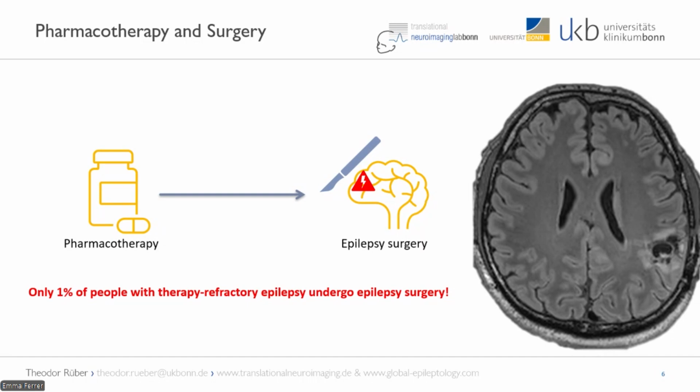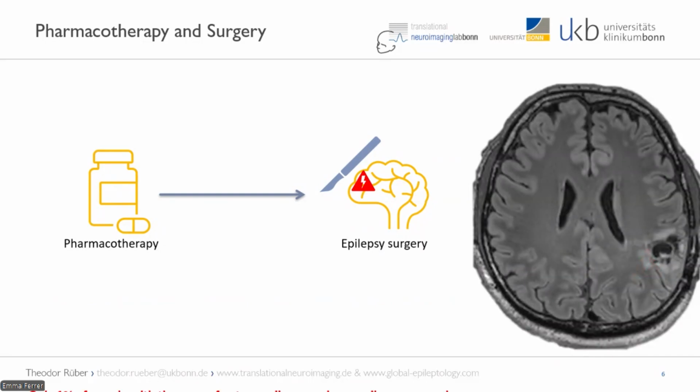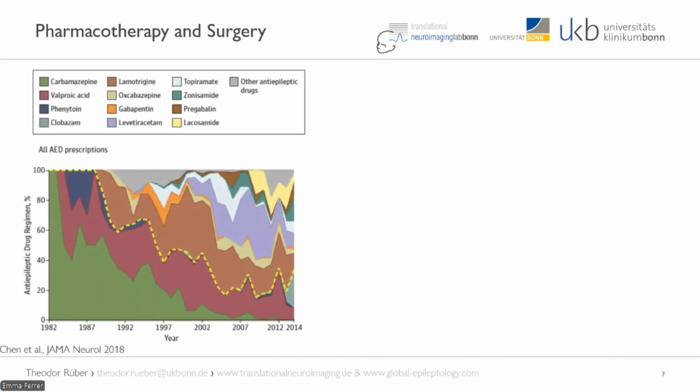And that is, I think, what Tony means when he talks about these killer applications, because we hope, and not only we as physicians, but also our patients cherish, that the ultra-high field will be able to localize these lesions. It is, of course, not as easy as this, but I'd like to show you how we try to use 7T to diminish the number of people that cannot undergo surgery.